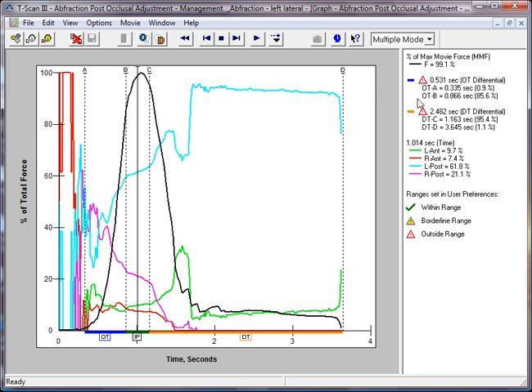So if the occlusion time had been okay, we'd have got a little green tick up here. If it's in borderline range, then it would have been orange, and it's actually outside a reasonable range, so it's come up with this little triangle here to suggest that it's outside the range. So the software is now doing some things to help out there.